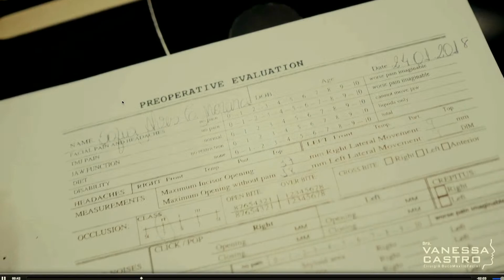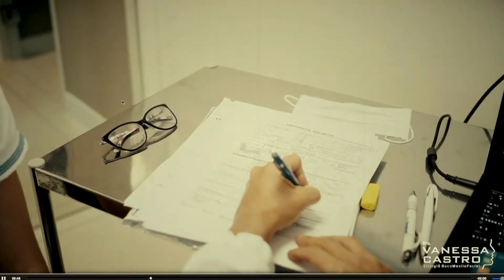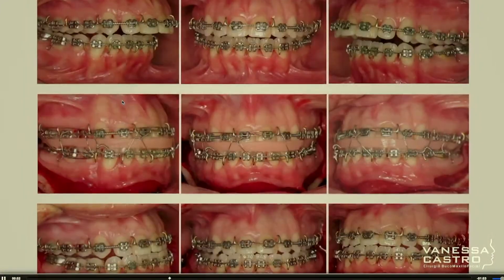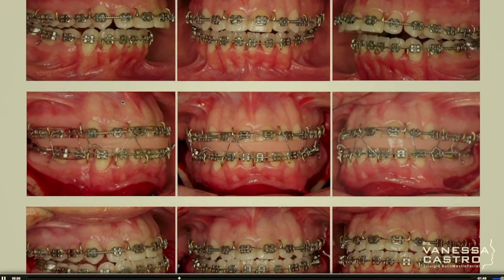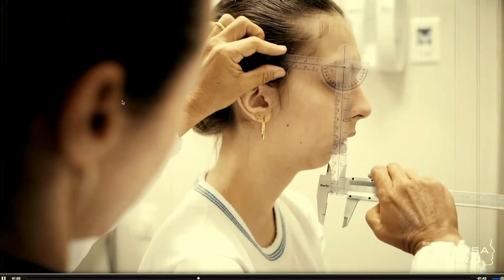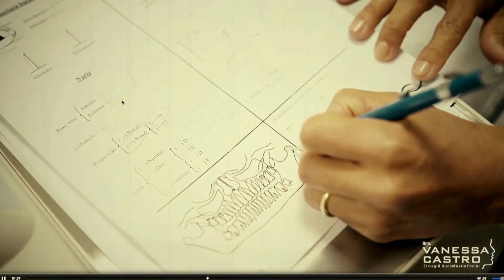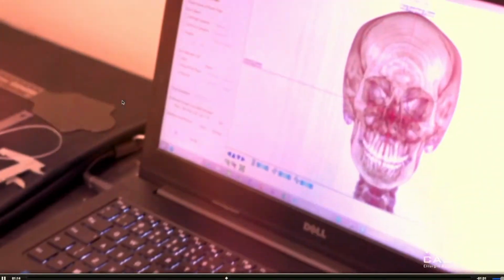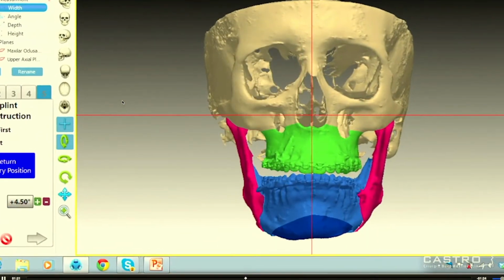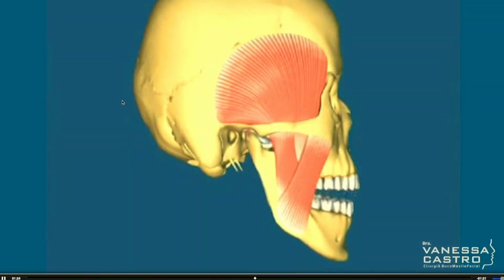But about the facial analysis, it is the same. We have all the measurements, we have the face of the patient in front of us, and we just reproduce in the models what I'm seeing in the face. So here you can plan the best way to do the surgery. And the facial analysis, even today, with all the technology that we have, the computers and the software, there is no other way to determine the movements that you have to do in your patient just with the software and the computer. You need to read the face and see the numbers of that face.